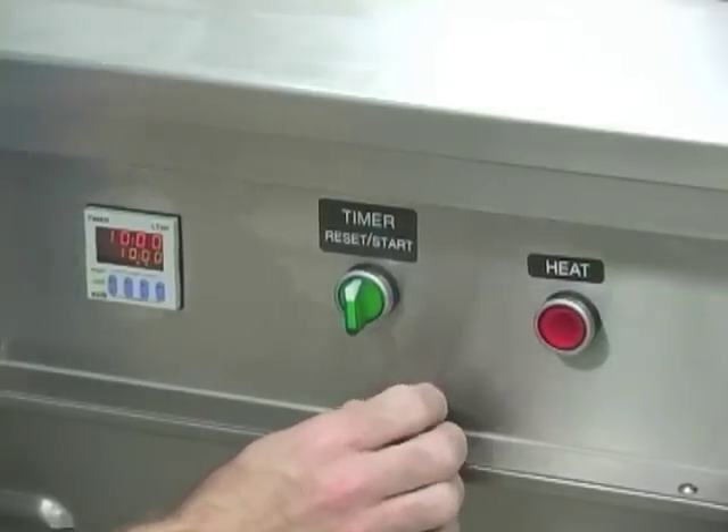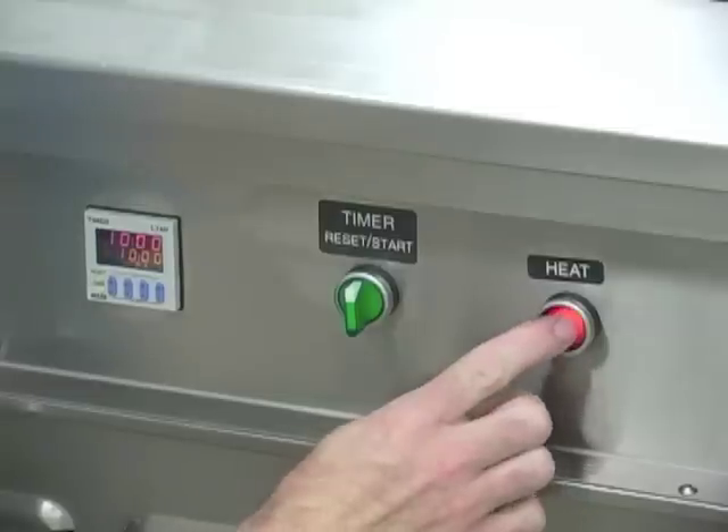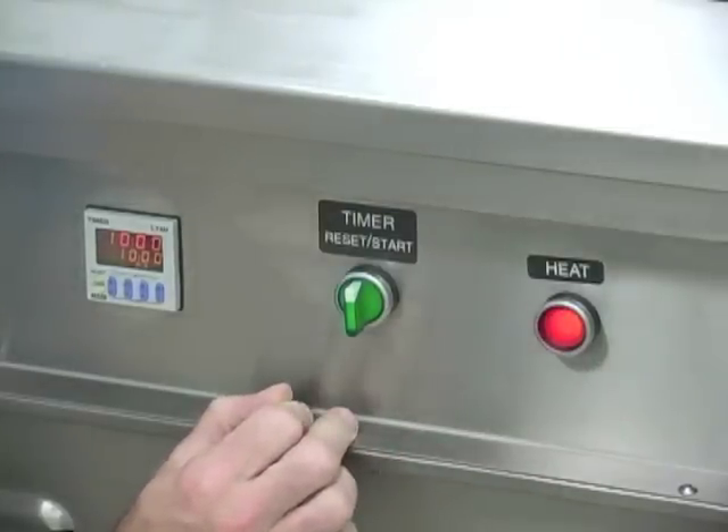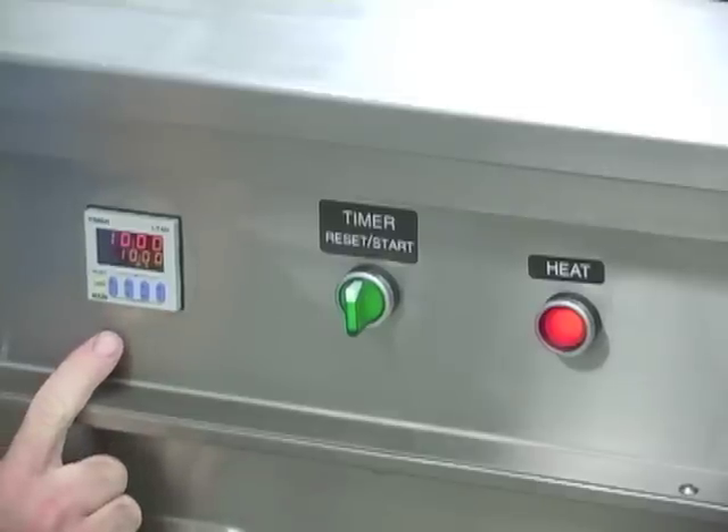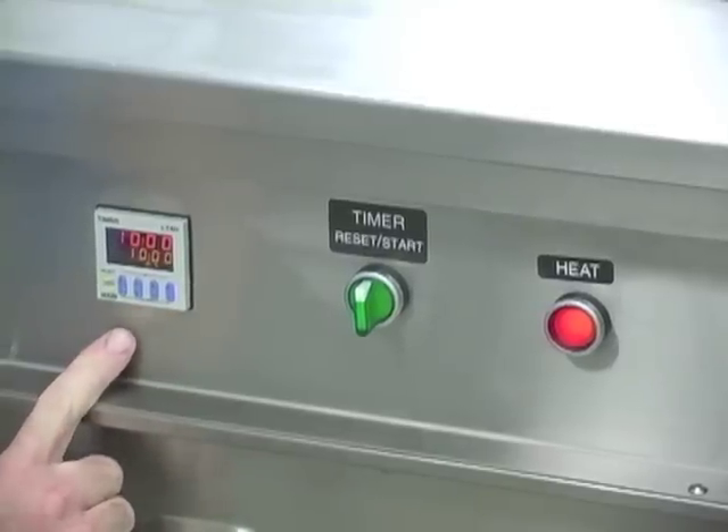When you first set up the machine to run, you need to turn the heat on for approximately 30 minutes prior to installing the tooling. The run timer ships out of Natoli Engineering set for 10 minutes.